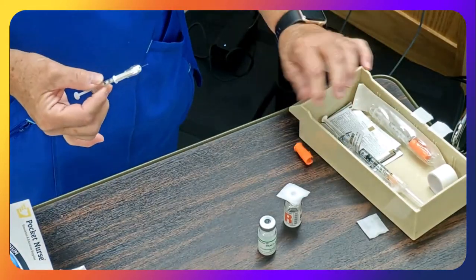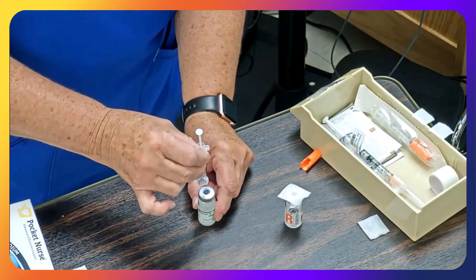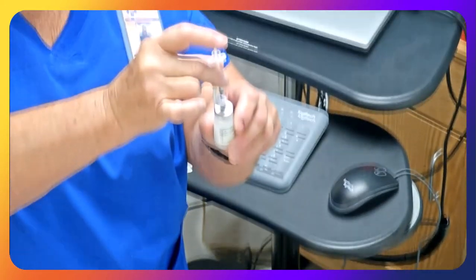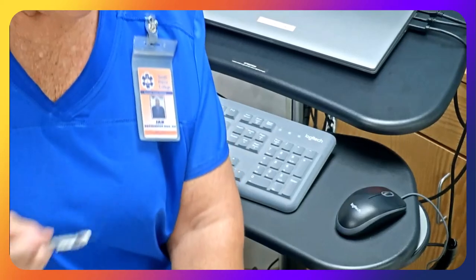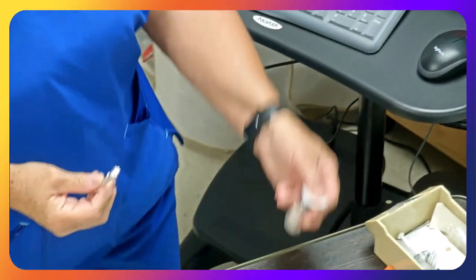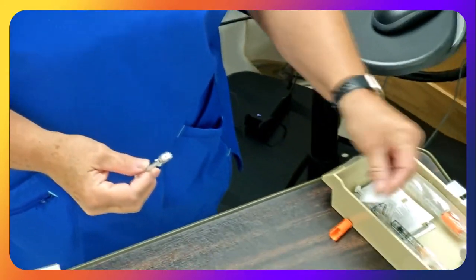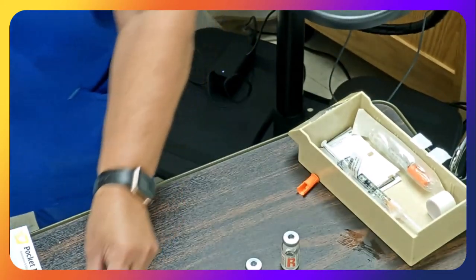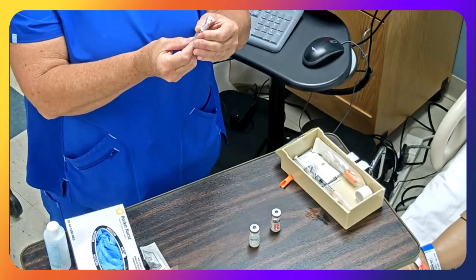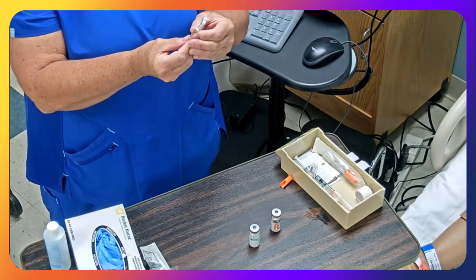You have to be very careful with this needle. And without touching my needle, without touching the solution, I'm going to go ahead and put my air in, take it out, okay? And then it says that I'm supposed to be using 8 units of my regular. So I'm going to get 8 units, 5, 6, 7, 8.